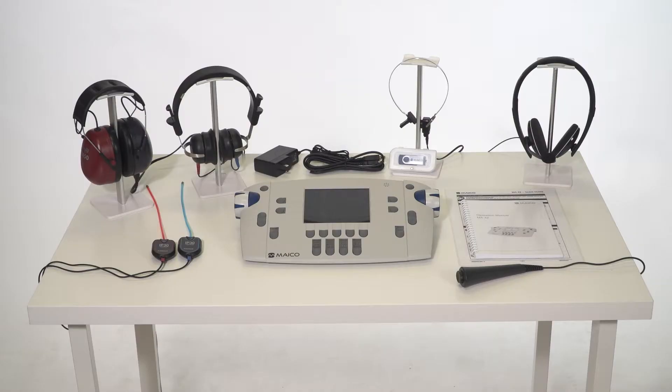This demo is to show you how to set up and use the MA42 diagnostic audiometer. Carefully unpack all items from the shipping box.